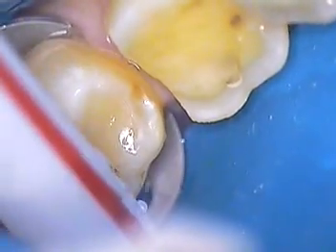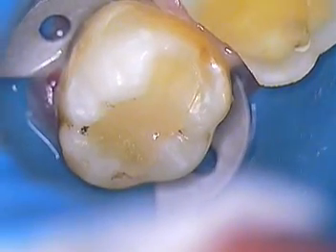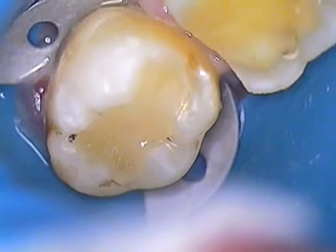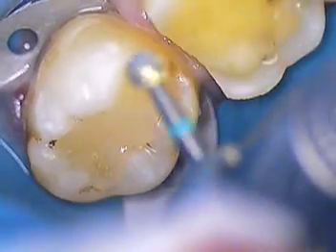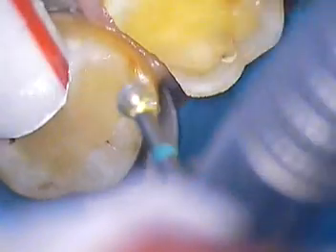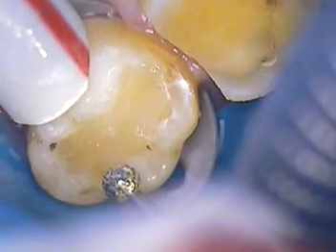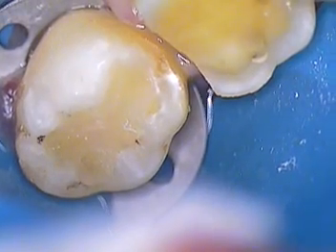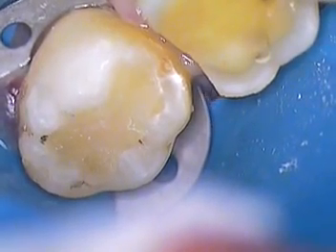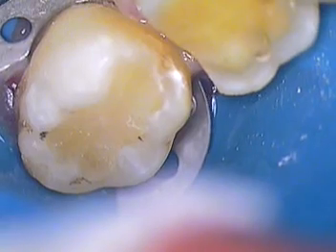We're going to do a little bit more on the same situation on the second molar, which is really a wisdom tooth. When we come back on the next segment, I'm going to have this tooth prepared. I want it to look a little bit more like this tooth — see how it's rotated — and we want to turn that around through our tooth preparations. Then we'll be ready for impressions. Dr. Jerry Cuomo here in Boca working on teeth numbers 17 and 18 — we'll look forward to seeing you at the next segment. Take care.